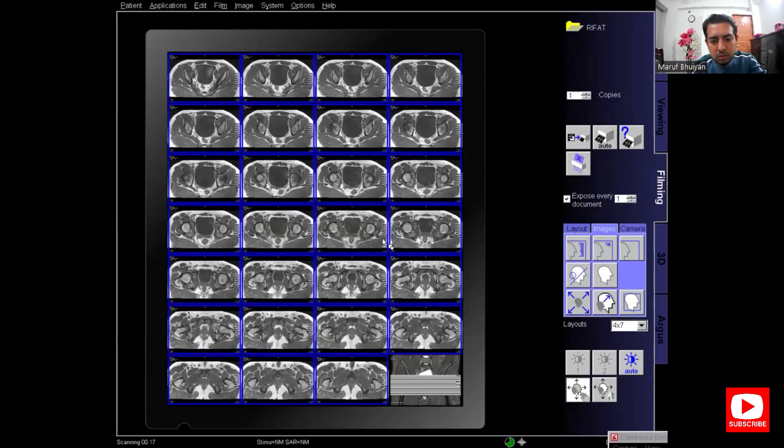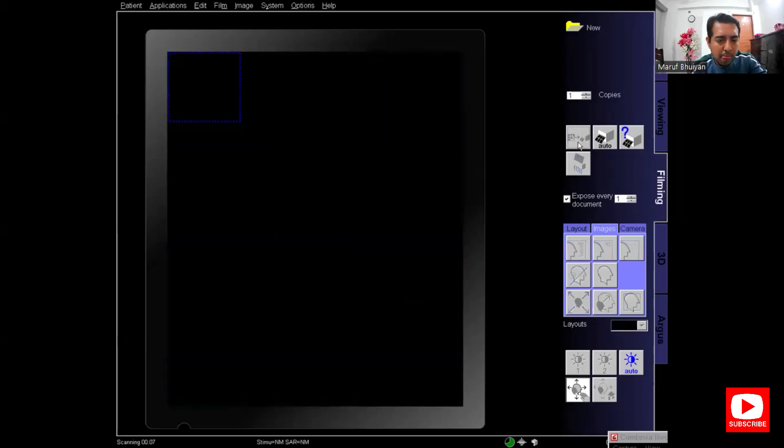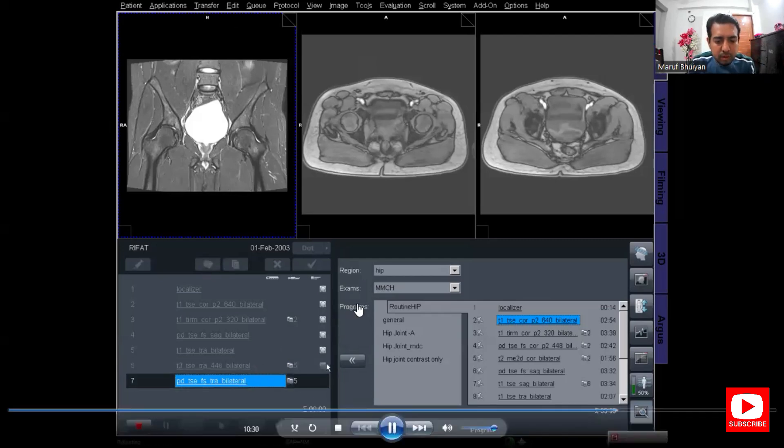Adjust the window carefully so that the contrast is very good on the image. T1 axial is printed. Now T2 axial and PD fat sat axial are scanning. The T2 axial scan has completed.